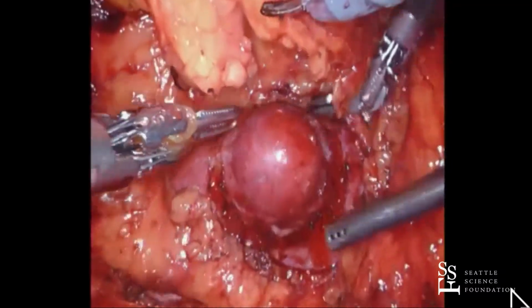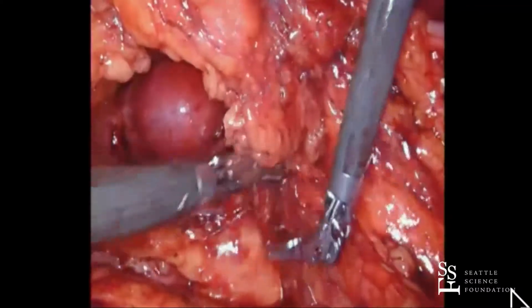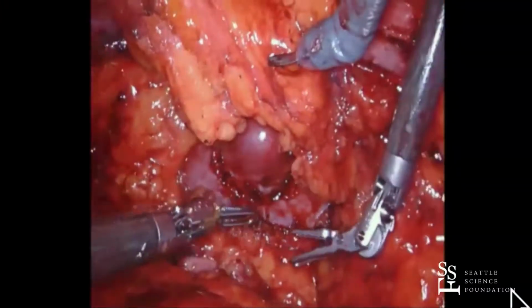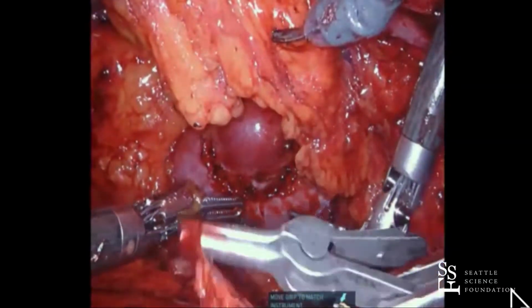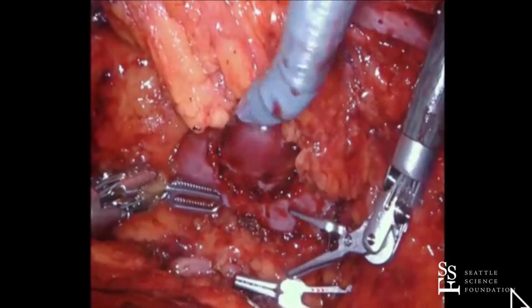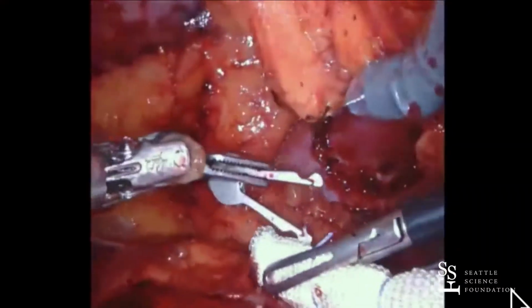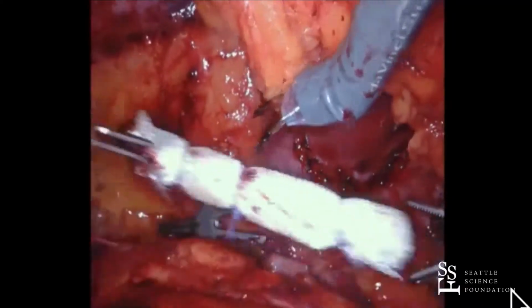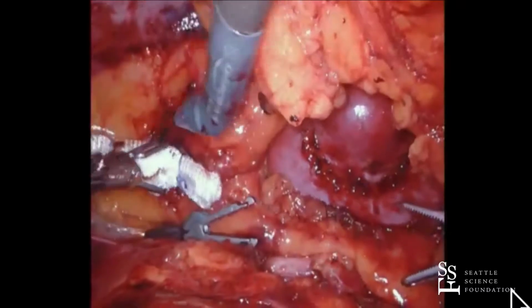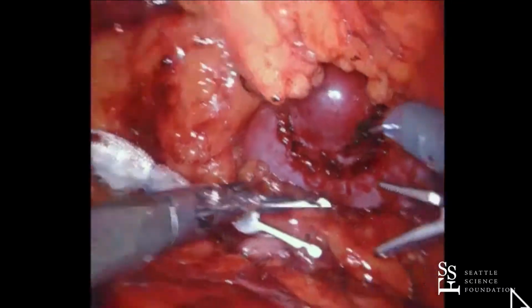Okay, so I think we're ready to go here. Let's have a bulldog, a medium bulldog, and a bolster. Another thing that you can use to figure out how deep you need to cut is to have an idea of what your proportion of exophytic versus endophytic is. So if you know from your CT scan, for example, that it's 50-50, then the same thing staring at you here is how deep you need to go. If it's more exo than endo on the CT, then you don't have to cut as deep as what's sticking out. So it's just kind of a general idea that you can use to figure out how deep to cut as well.